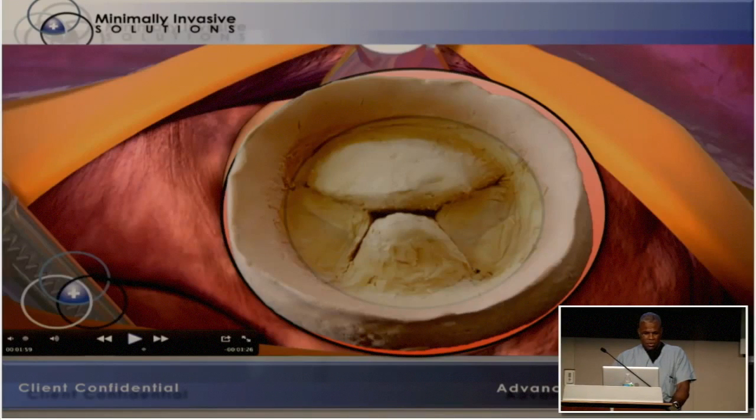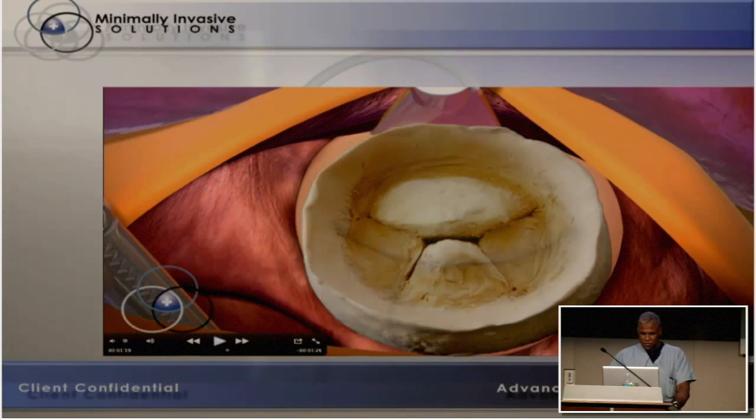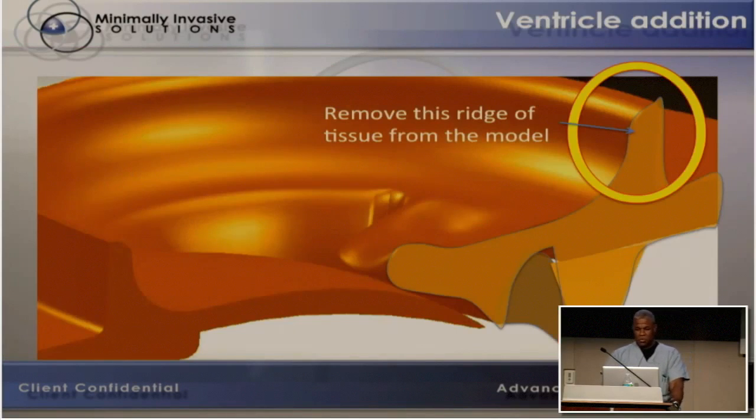And we took some simulations and positioned the clay image to determine how would everything fit spatially. So we created a 1-to-1 size model out of clay and continued to work with that. So they finally sent back, and this is what we thought was pretty cool, they finally sent back their idea.